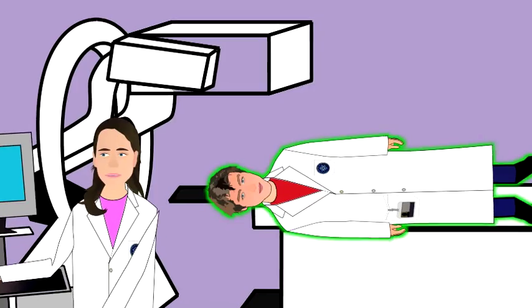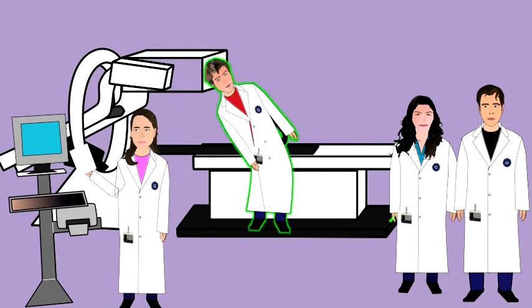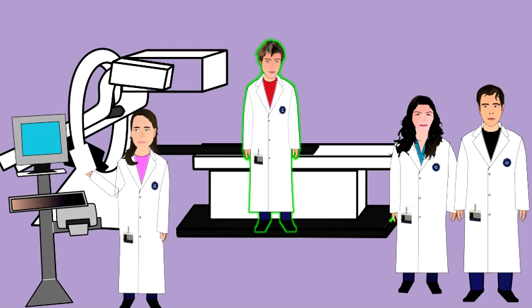All nuclear medicine equipment must be checked daily and calibrated to ensure it is in working order. So, what's my diagnosis? Sorry, we're not allowed to tell you that. We send the picture to your physician, who will interpret the scan. So, will I have any side effects? Nope. With the dose of the radiation we're giving you, you will be completely normal after it leaves your system. We'll get you to drink lots of water to flush it out of your system, and you'll be free to go.